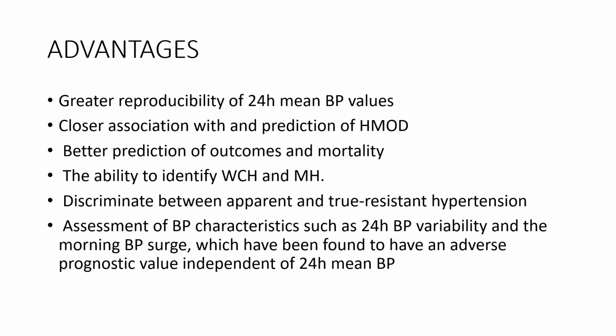Because it gives a 24-hour value, we want to know if the patient truly has resistant hypertension, which is defined as not being able to meet the blood pressure target, persistently more than or equal to 140/90, when the patient has taken 3 or more antihypertensives. So it's able to assess that.